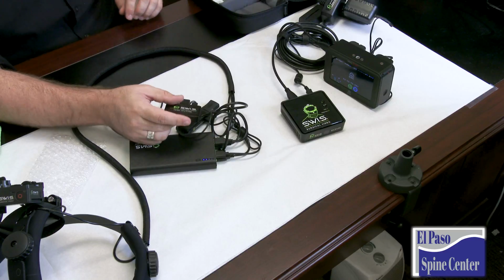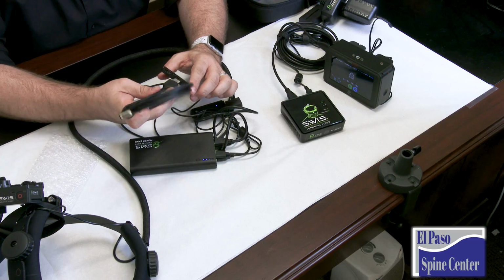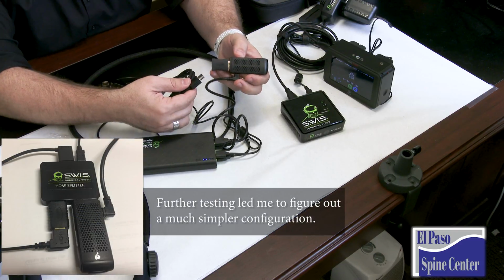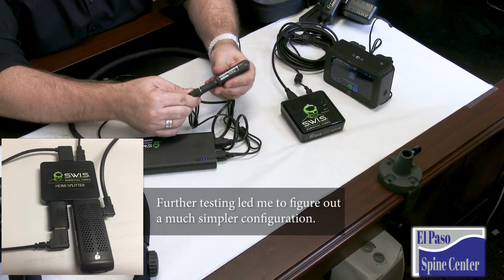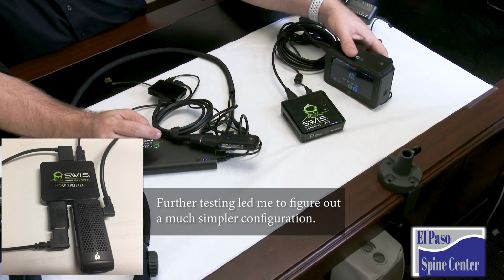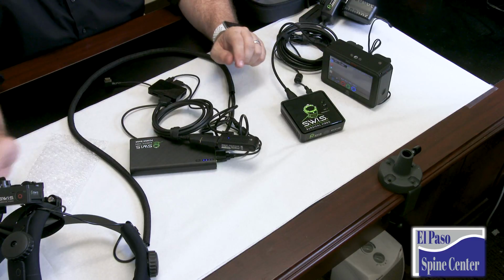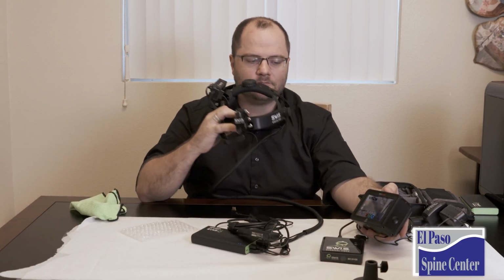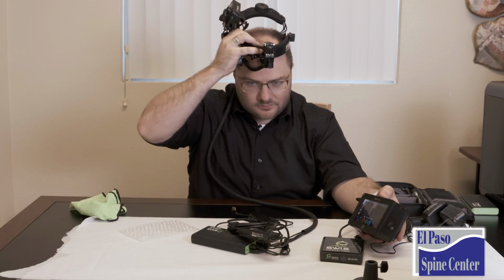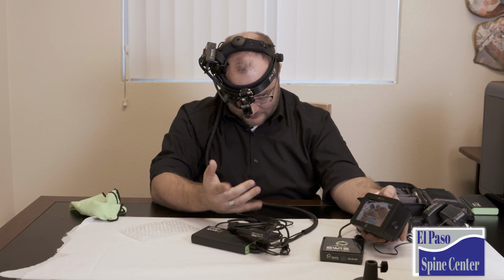out of my GoPro. I'm going to take this HDMI cable that came in the system. I'm going to plug that into my splitter. I'm going to plug that into my wireless system. And I get a green light here, and I should start seeing. I now have a wireless system that is seeing what I'm seeing. I can plug this in, I can look down. That's my hand right there.